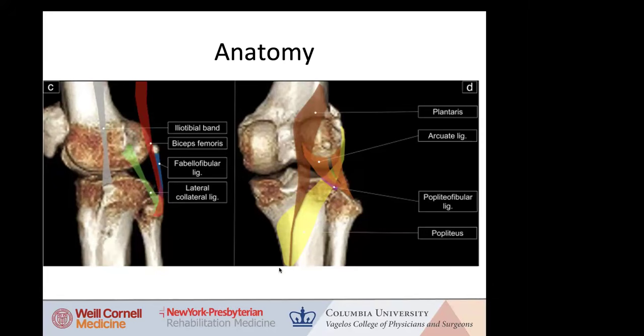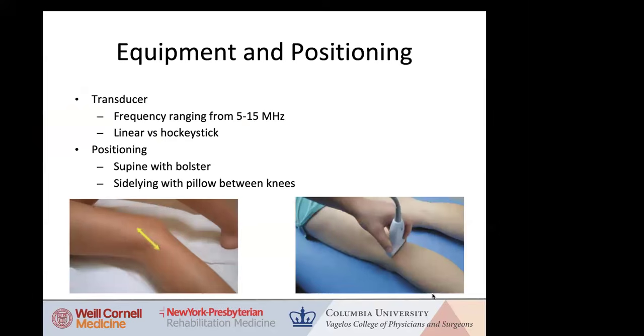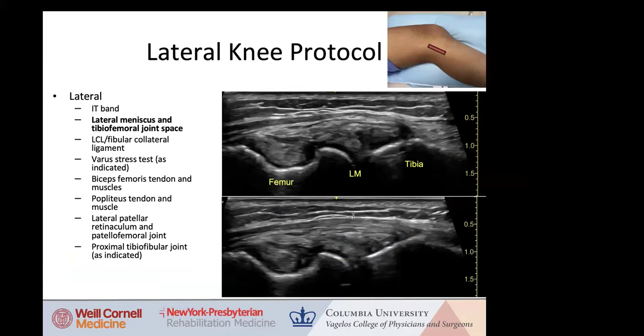You mentioned positioning for the lateral knee, and this is something that I struggle with. I move my patients back and forth probably more than they want to be moved, just based on how things look to me and what I want. I typically have people start in that lateral position, and then you can rotate their hip a little bit, often if they don't have any hip problems, to get almost like a prone position while they're still side lying, and then you can externally rotate their hip. And if you have a pillow between their knees, you can sometimes bolster and position them where you don't have to do quite as much movement. And so that can sometimes be helpful. But if you're really getting to the posterior knee, you sometimes have to move people back and forth, which they don't always love.